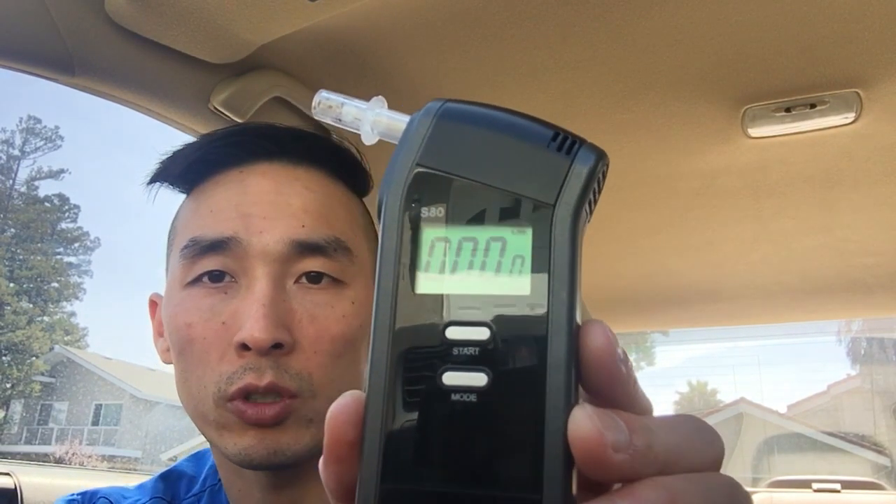Sorry for the glare. Obviously I haven't been drinking any alcohol and it's reading 0.000. You can take multiple readings. It 100% does work. I do have to go back to work so I don't want to drink something, but I promise you if you try drinking something and test it, it will detect more than 0.000.